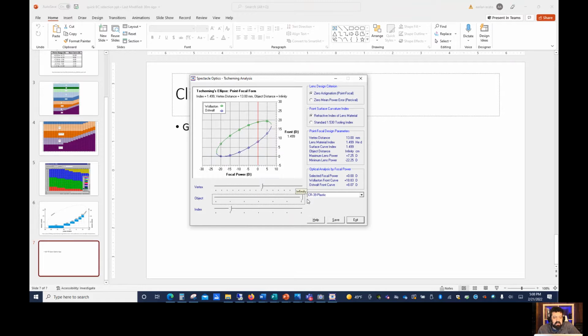Turns out that my working distance matters: if I'm doing something at infinity distance, or something at close work or computer, notice how, based on the lens design in this particular formula, this particular device, if I wanted an object at distance, it's going to give me a different series of base curves. Now, if I had different materials, like a 1.74 high index, notice how this is changing as opposed to CR-39. The whole curve changes to optimize the outcome.